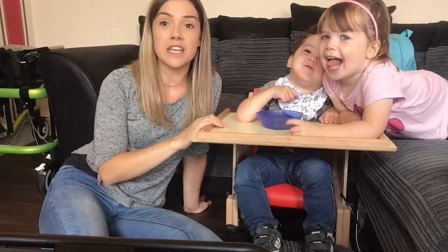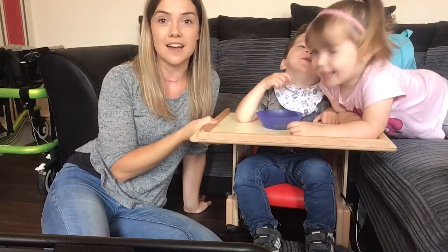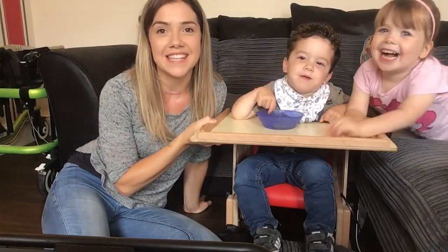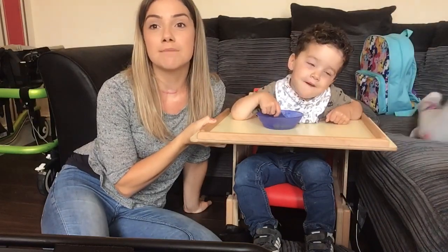Hello! Today we are going to be reviewing the Heathfield chair, which is this one that Wilson is currently sitting in. The Heathfield chair is a special needs chair that provides mild support.